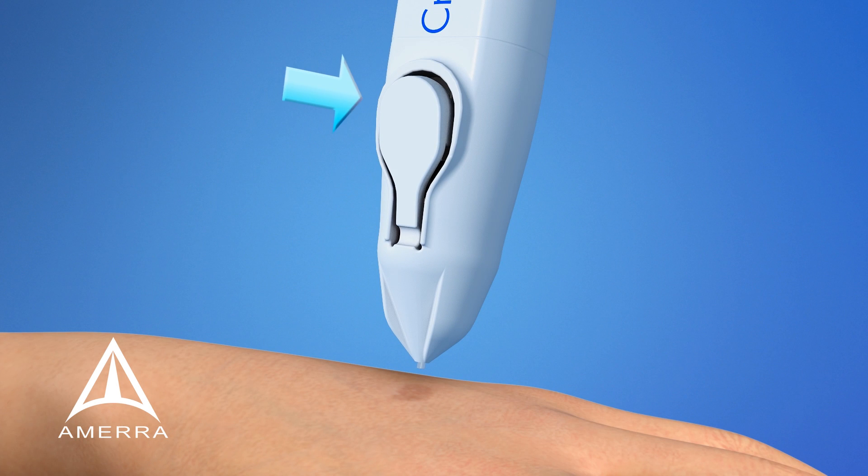Using the tip of your thumb or forefinger, press firmly on the button to release the gas. Please refer to our treatment guidelines for specific treatment times. We recommend using one, or at the most two, 5-second sprays based on the size, degree of pigmentation, or location of the treatment site. CryoClear should not be used for more than 5 seconds during any single treatment.